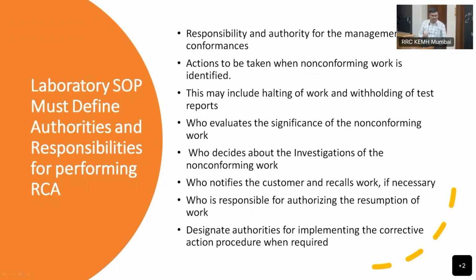एक funny example देता हूँ. एक बार क्या हुआ कि we are doing hemoglobinopathy from HPLC. Okay. So it is our indigenous method. We have developed our own method, HPLC.